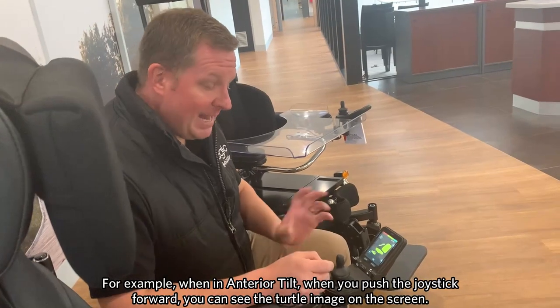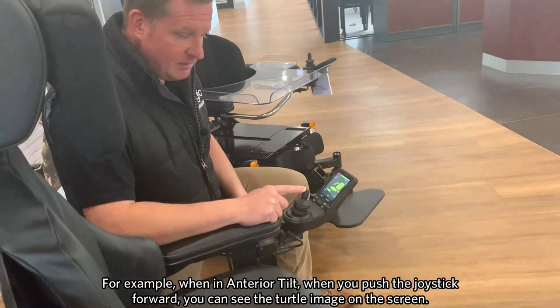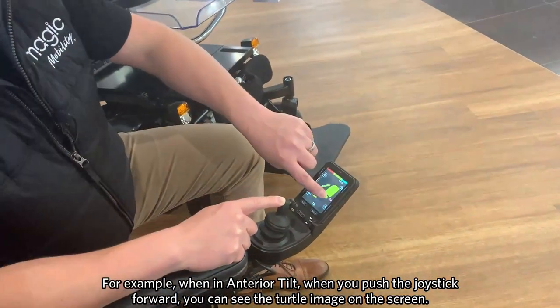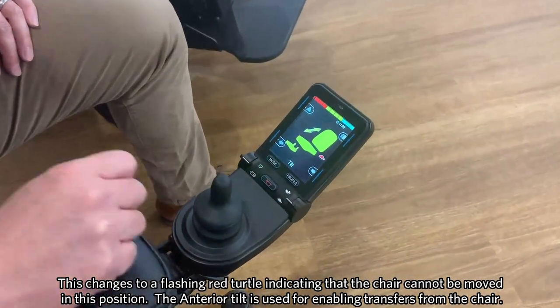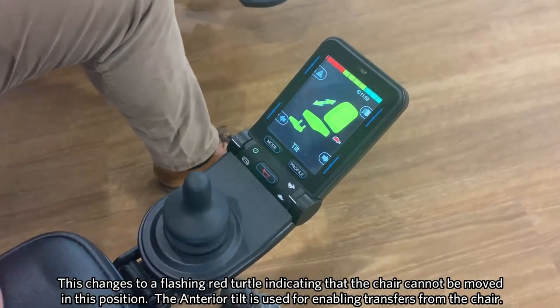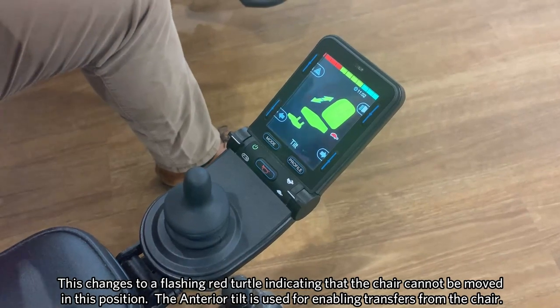For the example of our anterior tilt, if I push the joystick forwards we'll start to go into anterior tilt, and as you can see this turtle image has come up. Now a red flashing turtle image has come up just to show you that the chair won't be able to manoeuvre in this position, because this tilt is for enabling us to facilitate a transfer.